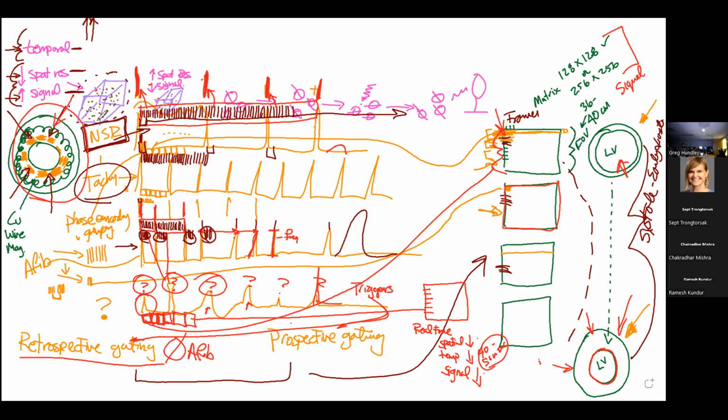Additionally, we've got to deal with respiratory motion and breathing. So what we identified, we look at this normal sinus rhythm, is that the motion of the heart is rhythmic. We started with a heart rate of 60 beats per minute. And we showed that if you could collect information synchronously over time, in windows of time, repetitively, we could create movies of that wall motion over here. Just like the movie film in Oppenheimer shot at 70 millimeters. Which apparently is pretty impressive if you go to a movie theater.